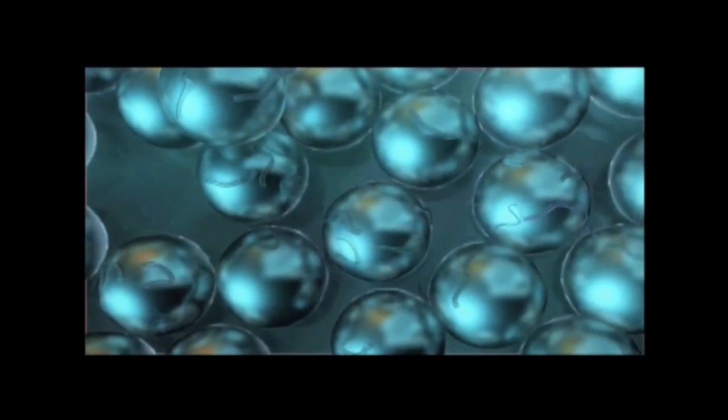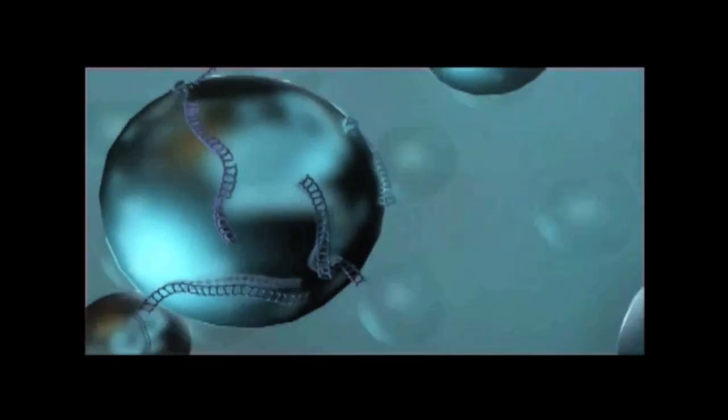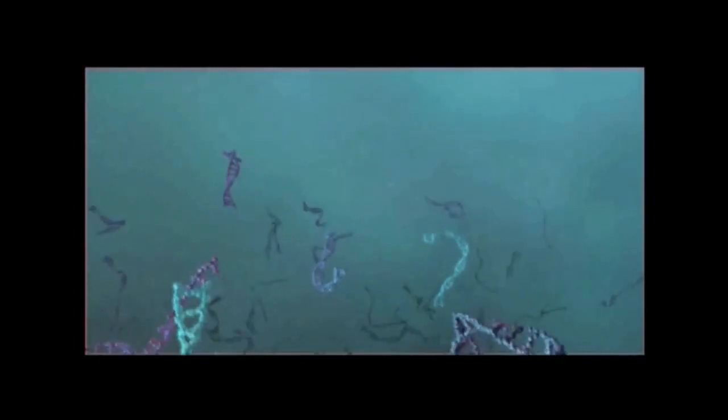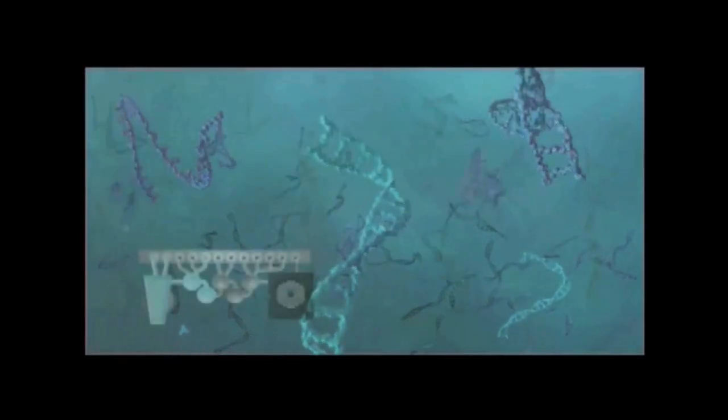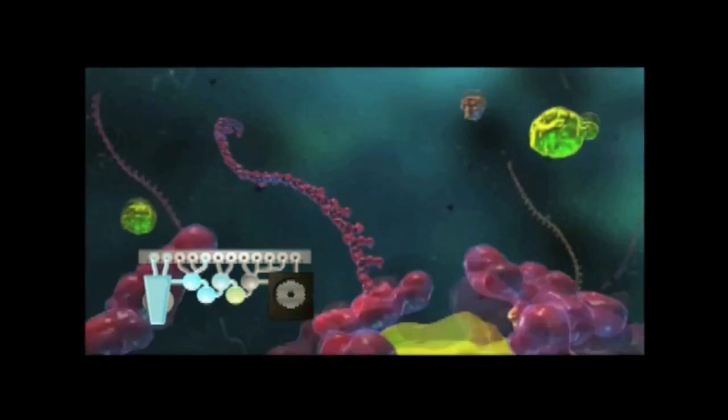Here, a wash buffer removes any remaining cellular and viral debris. The FilmArray activates a magnet outside the pouch, which holds the magnetic beads in place while the debris is washed away. Next, an elution buffer releases the purified nucleic acids from the magnetic beads. The magnetic beads are again magnetically secured while the nucleic acids are moved to the first stage PCR chamber.